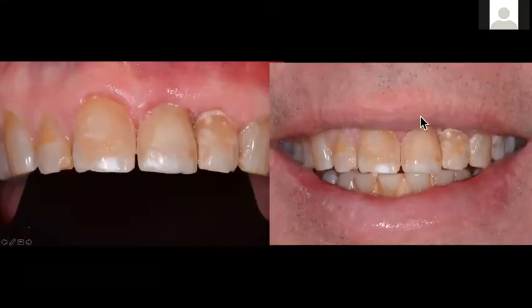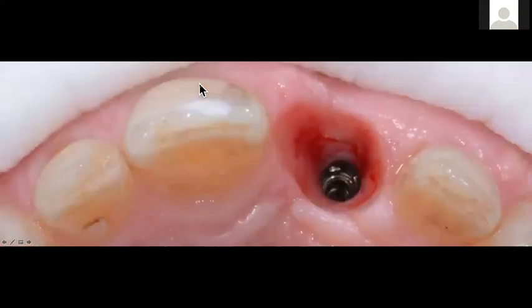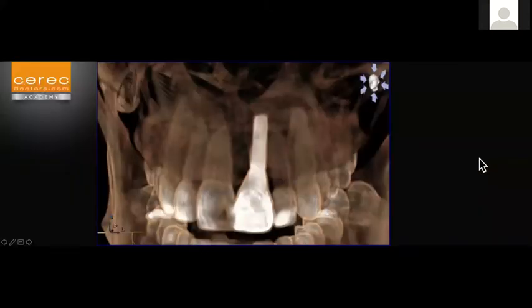Now we can go ahead and we see this. The patient didn't have real good oral hygiene, but then Dr. Kvechen started developing this even more with the provisional, to push this gingival margin out to exactly the same level as the contralateral tooth. Here you can see the nice development with the custom tissue former and then with the subsequent provisional. Here he's drawing lines to add more contour to the provisional to start pushing on this gingival margin. You can see the blanching here so that it's on par with this contralateral central, and eventually he achieved that. So now we've got good symmetry before he went to the final.